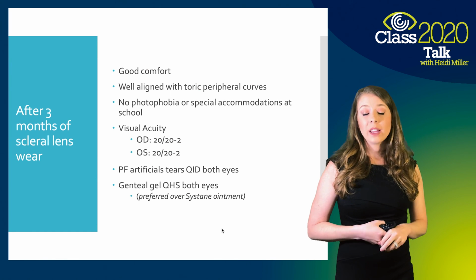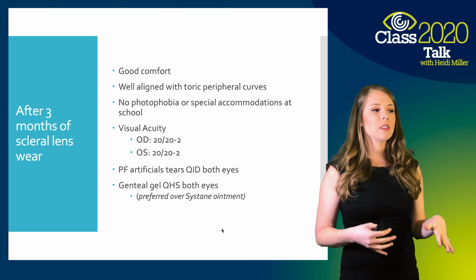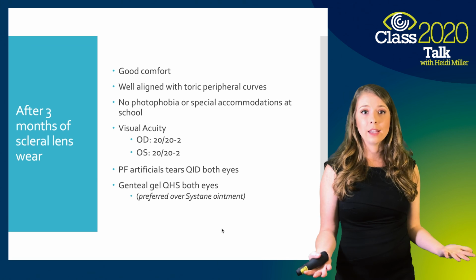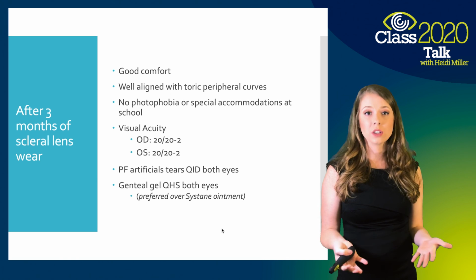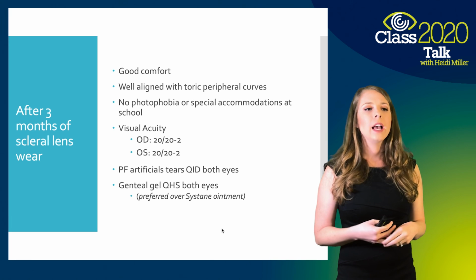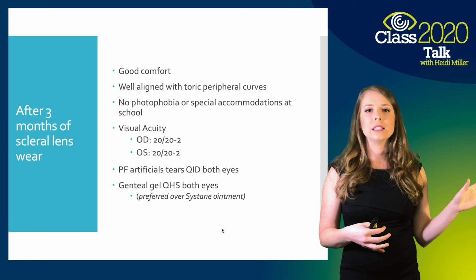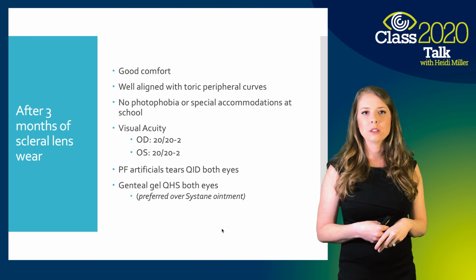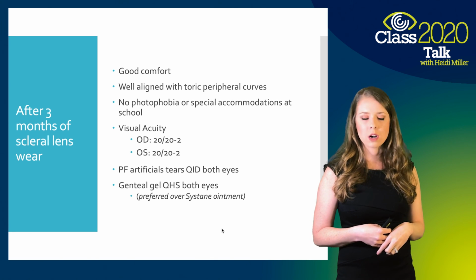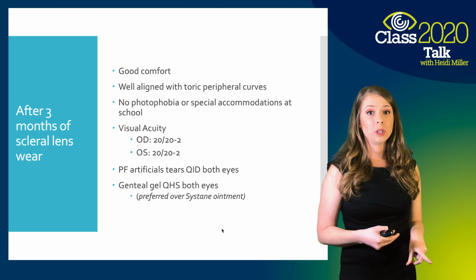After 3 months of wearing the scleral lenses, she had very good comfort. Parents reported that they could see a difference in her personality, a difference in the way she carried herself day to day. She seemed happier. She was able to keep her eyes open more. Did not have any complaints of photophobia. They did not have to do those special accommodations at school anymore. She was not sitting in the dark in the corner. And you can see the vast improvement in her visual acuity.